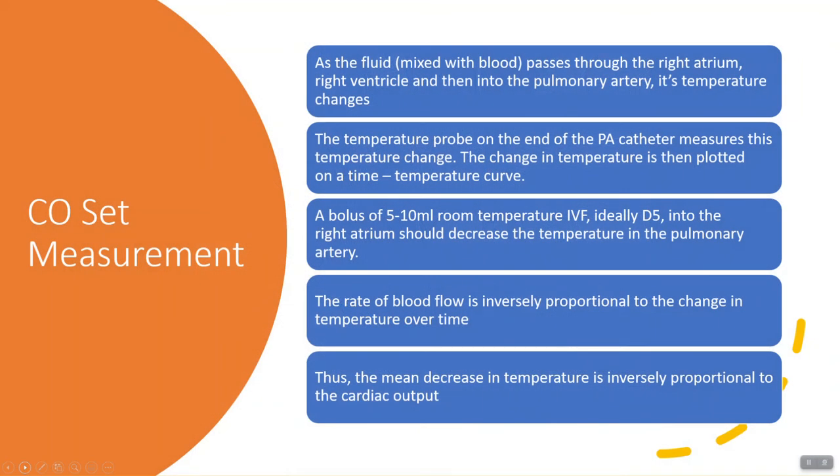As the room temperature D5 mixed with blood passes through the right atrium, right ventricle, and then into the pulmonary artery, the temperature changes. The temperature probe at the end of the PA catheter inside of your patient measures this temperature change. The change in temperature is then plotted on a time-temperature curve on the bedside monitor. The rate of blood flow is inversely proportionate to the change in temperature over time, and this decrease in temperature is inversely proportionate to cardiac output.